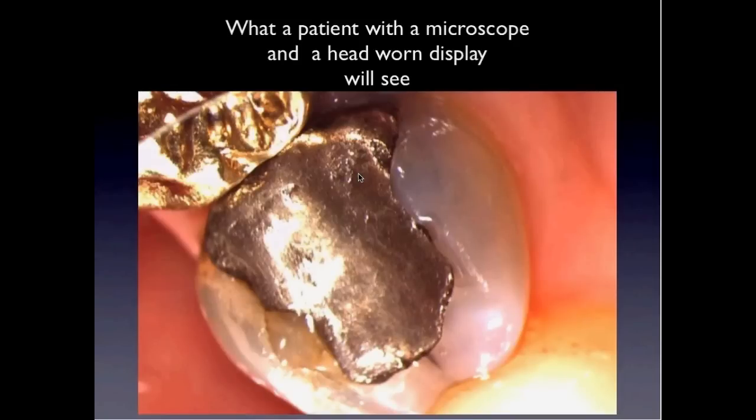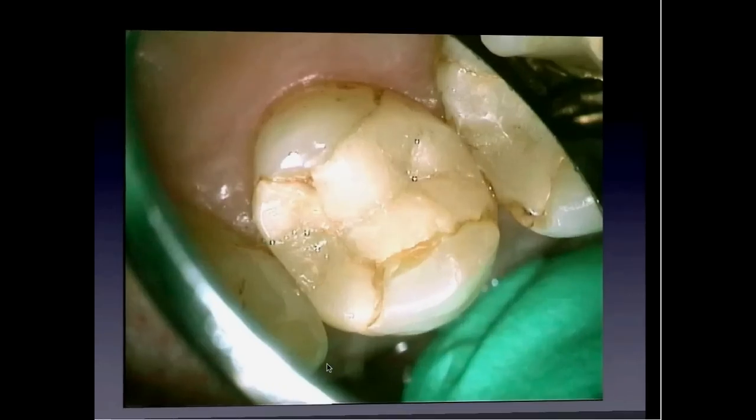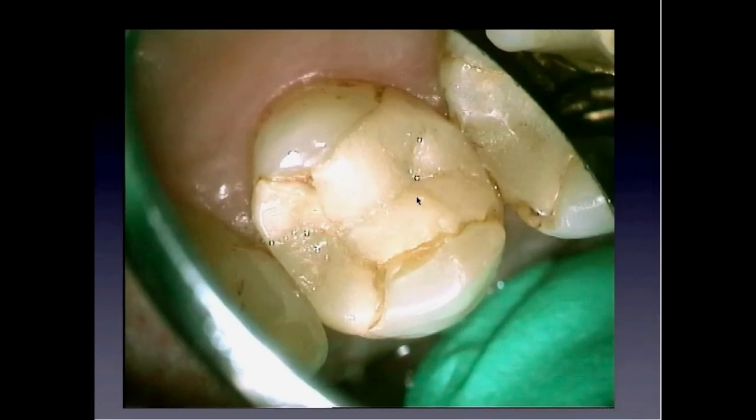What do you think a patient thinks when he sees this picture here, or you see this through the microscope? He can very easily detect that the old amalgam filling is not good anymore. It's no longer leakproof, and it has been repaired already once. So he will decide to do something about it. This tooth will need a crown, and there will be no debate about that question. Or these wonderful fillings here will also be changed very rapidly, I think, if the patient had to decide.